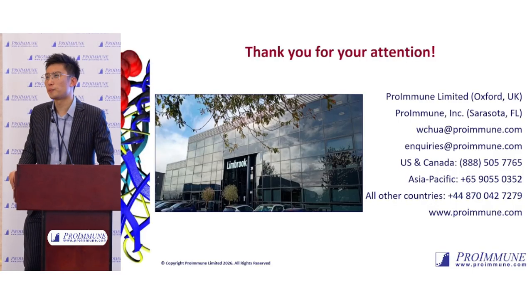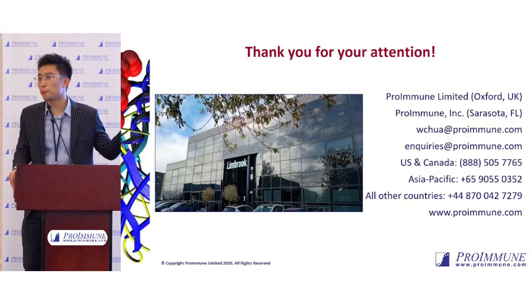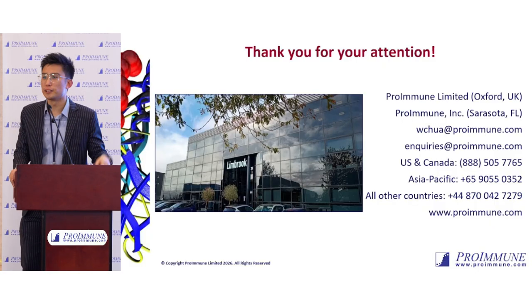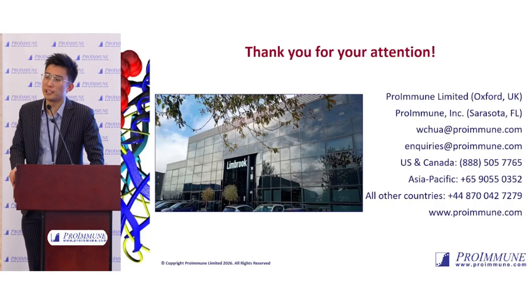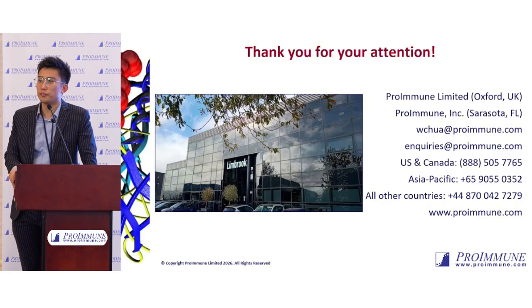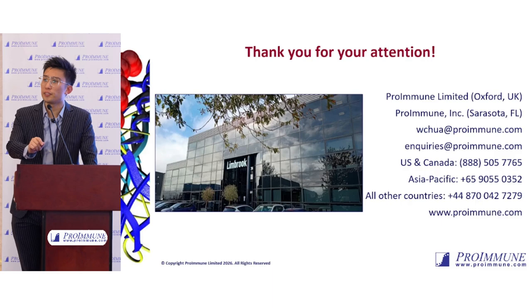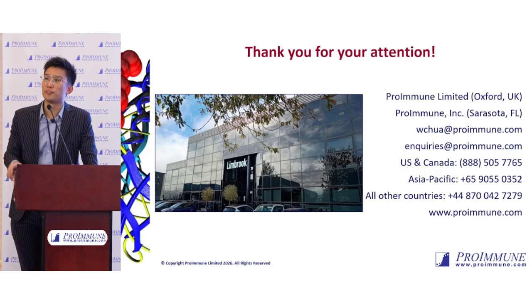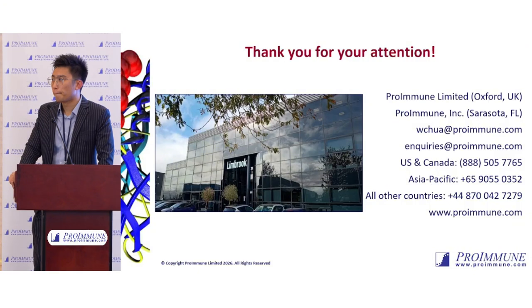So it really depends on perspective. The good news is that you don't have to identify what the impurities are. At least for generic peptides, there is no specification of what these innate immune response modulating impurities, the IIRMIs, are. You don't have to identify these innate immune triggers. They just expect you to test holistically your 3 batches of your drug product against 3 batches of RLDs. It's only on the adaptive side, the peptide-related impurities, that the agency expects you to identify and characterize them. Okay, thank you.